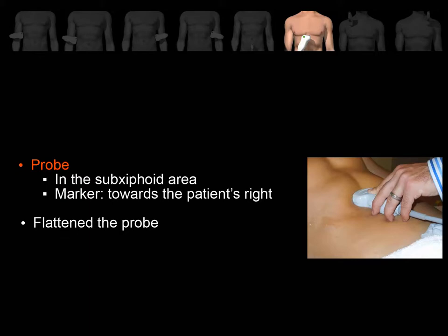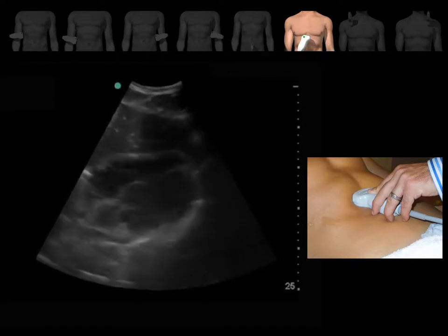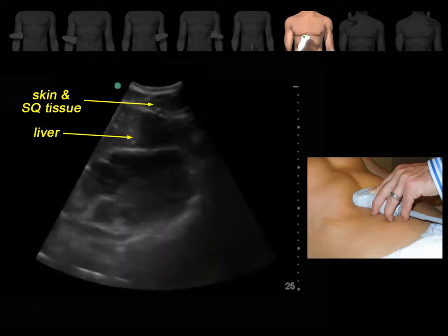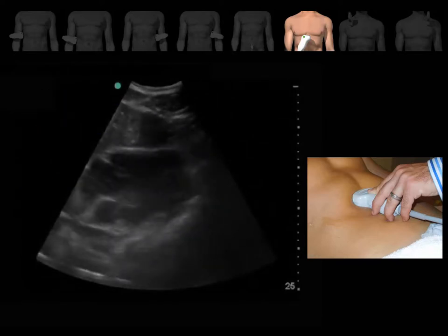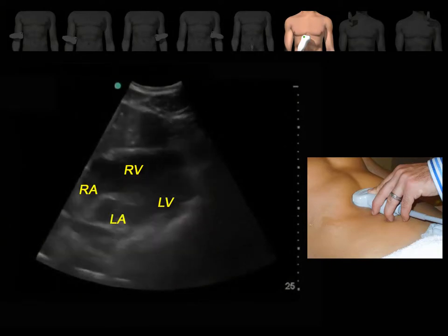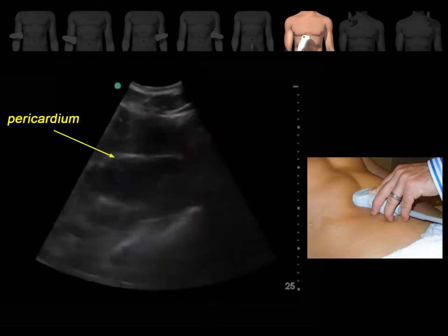The sub-xiphoid view. Place the probe in the sub-xiphoid region with the probe marker towards the patient's right, directing the probe towards the patient's head. The liver is used as an acoustic window in this view. Hold the probe from the top so you can decrease the angle between the probe and the skin. Starting from the near field, the structures you should see are the skin and subcutaneous tissue, the liver, and the heart. The heart chamber close to the liver is the right ventricle, followed by the left ventricle, right atrium, and left atrium. Normal pericardium consists of a single hyperechoic white line surrounding the heart.